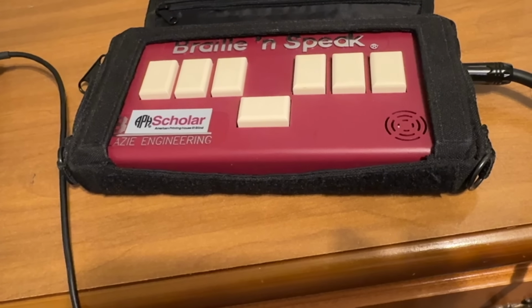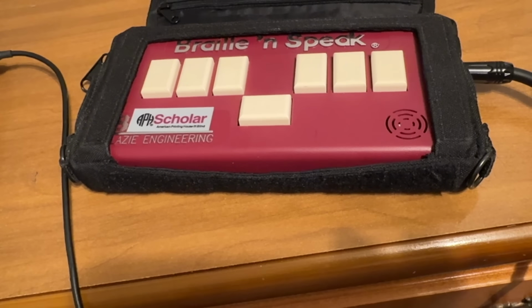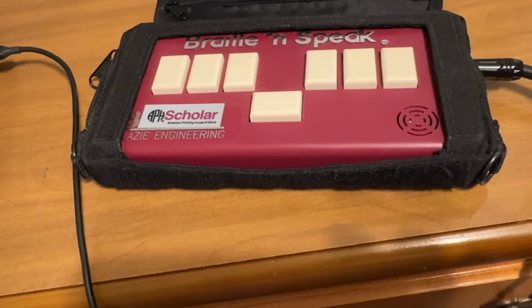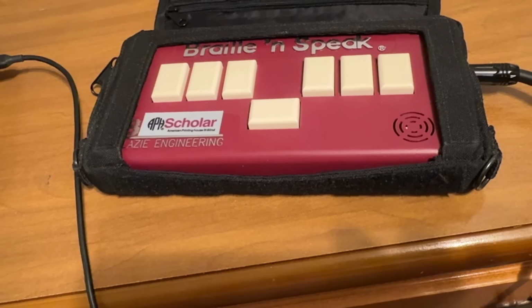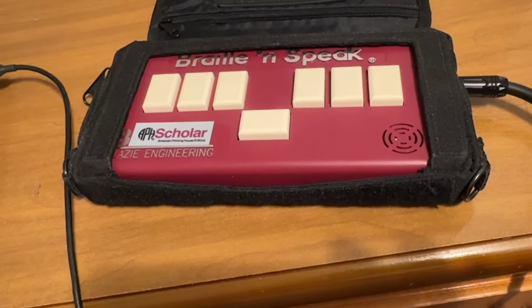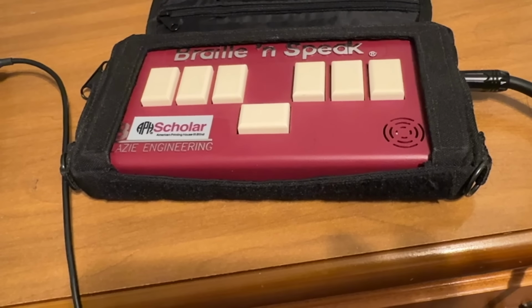finished, $DSF. End formatting, this terminates program, $F. Insert current time into text, $TM. Insert current date into text, $DT. Header begin, $HB. Footer begin, $FB. Disable header, $H dash. Re-enable header, $H plus. Disable footer, $F dash. Re-enable footer, $F plus. End of header or footer text, dash. Reset Braille translator setting for file, $BRL plus. Assume file is computer Braille, perform no translation, $BRL dash.